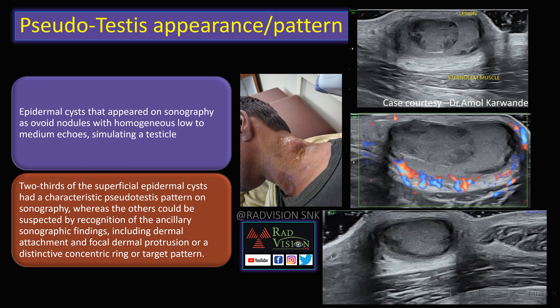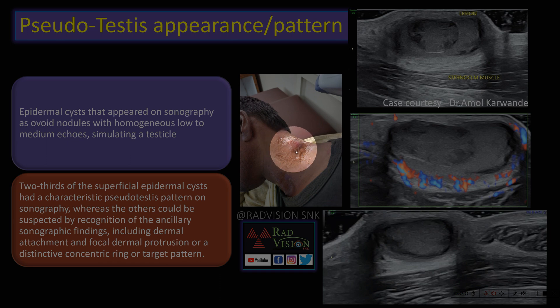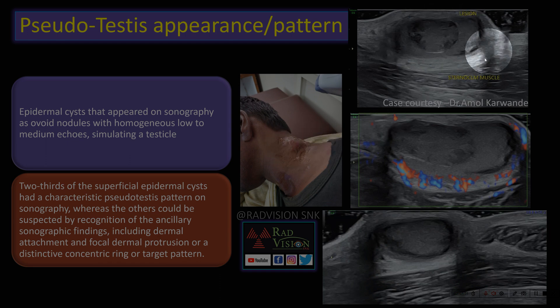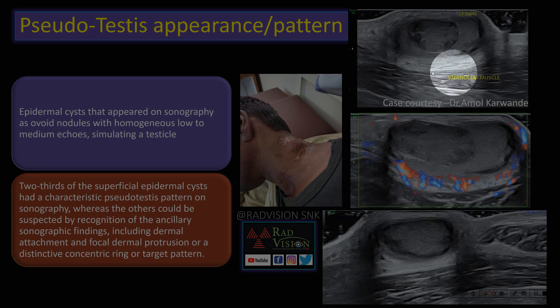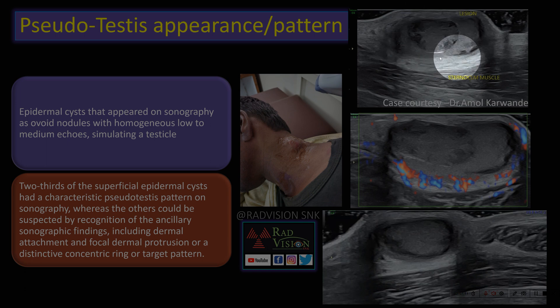Next case — what is the pseudo testis appearance or pattern? This was a case where a young boy presented with swelling in the sternocleidomastoid muscle. Typically, you can see a lesion — a hypoechoic lesion — which has low, homogeneous to medium echoes.